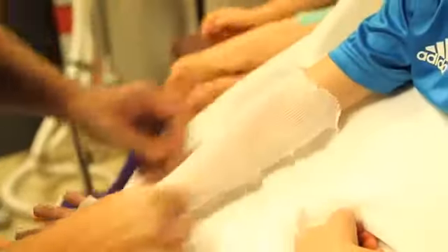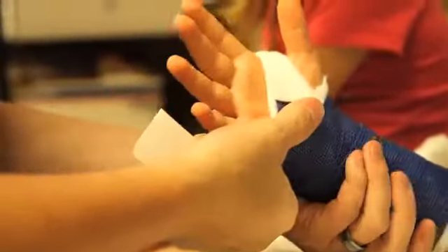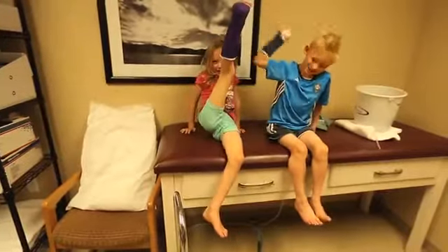It's gonna be like your sister's — put a big sock on your arm like a puppet. It's a soft fuzzy piece so you don't end up with a blister. There you go, this is awesome — the day we got a cast on!